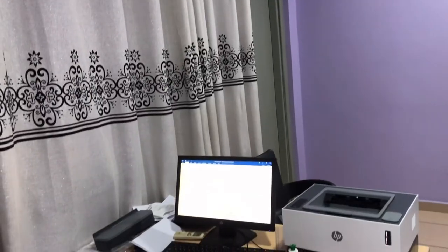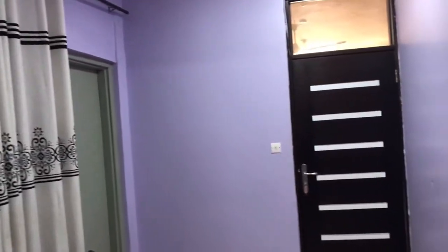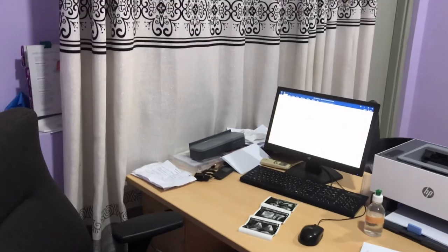Over here we have a sink and some sanitizers and some soaps and chairs. And over here is where we type the reports — that is a PC you are seeing with a printer, your desk and your chair and all that.